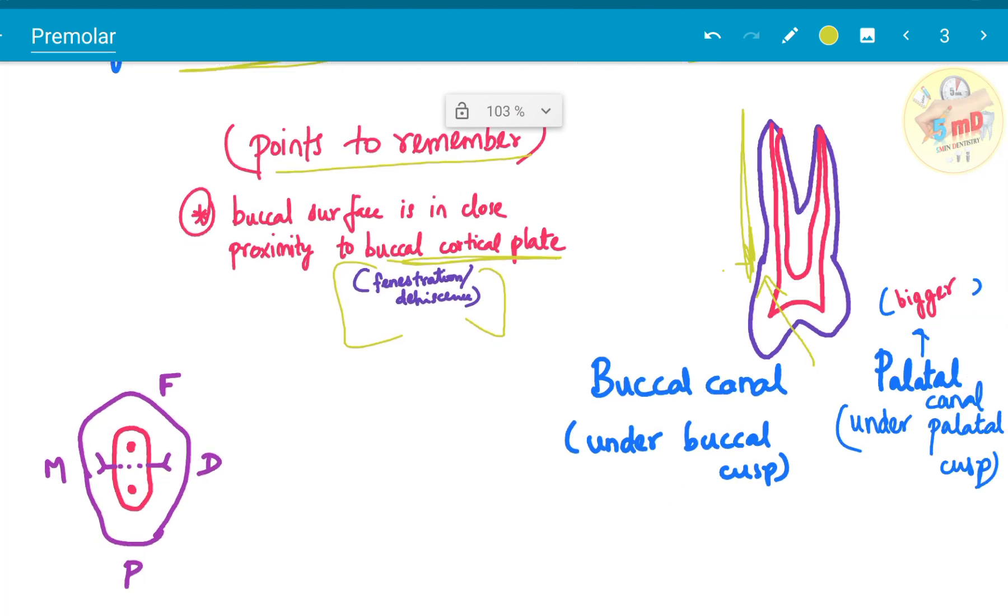The buccal canal is under the buccal cusp. Palatal canal is under the palatal cusp and it is bigger in dimension. So it is straight under the cusp.